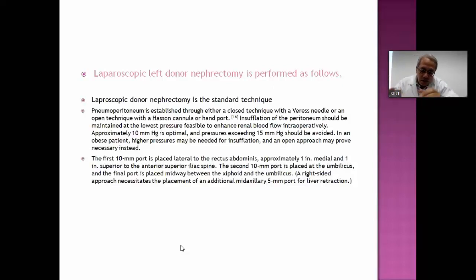Whenever you are doing surgery in a closed compartment such as laparoscopy, you have to understand a lot of different parameters. When you do surgery by an open technique, you put an incision and open up the space, whether it is a laparotomy or the retroperitoneal space, and everything is opened up. So there is no pressure effect because there is no closed compartment. But when you do laparoscopy, or for instance endoscopy, there is always a closed compartment.